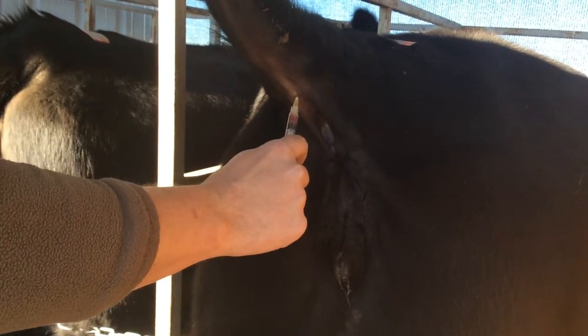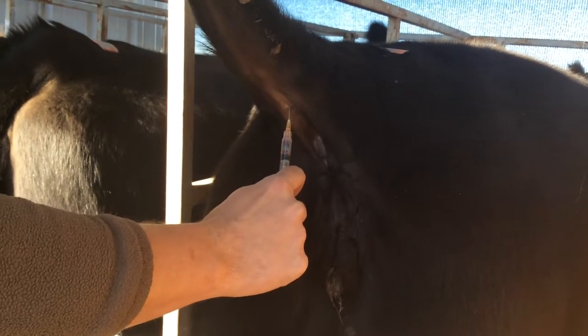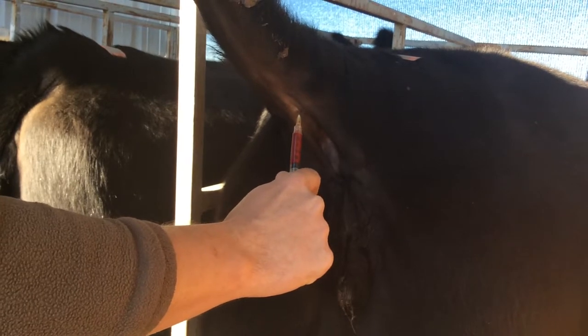Once you hit the vein, blood will rush into the syringe due to the vacuum. Pull back on the plunger and keep a steady pressure. If you do not get blood, redirect the syringe and the needle.